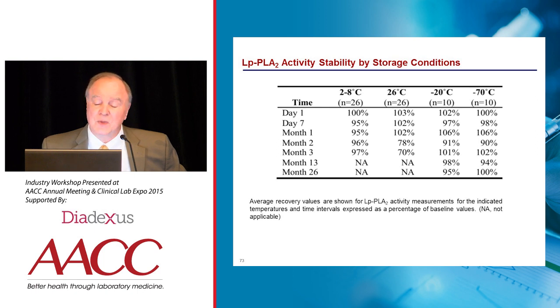The other thing that's kind of interesting, and you heard some about this, the molecule in terms of its activity is pretty stable. Even at room temperature, in this study that we've been able to do, we've been able to show that the molecule is pretty stable if you centrifuge it straight away. And if you start at -70, for the researchers in the room, you can get great stability over a long period of time. And so I'm thinking for the studies that are going to show that this molecule perhaps is more efficacious than we think now in predicting coronary vascular disease, I'm thinking that this storage study here is quite helpful.